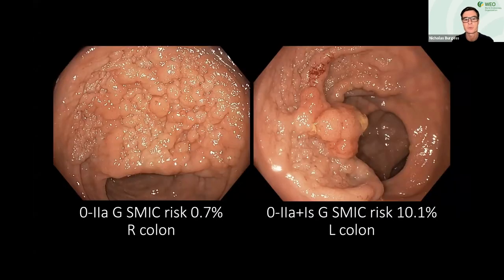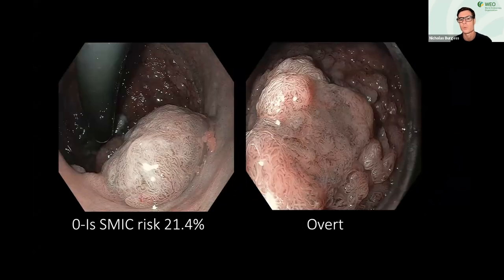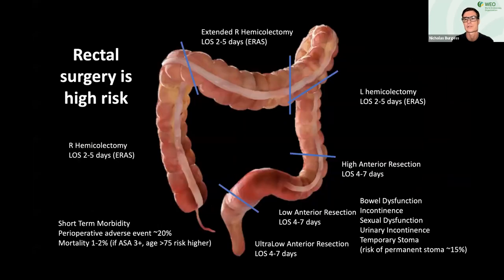So for these examples, a proximal right colon granular IIa lesion will have a low risk of cancer and is a good target for EMR. If it's got a nodule and it's in the left colon, it may have a higher risk. And lesions that are Is in the rectum may have a considerable risk of submucosal invasive cancer. So these are lesions that should be targeted for en bloc endoscopic resection or ESD.